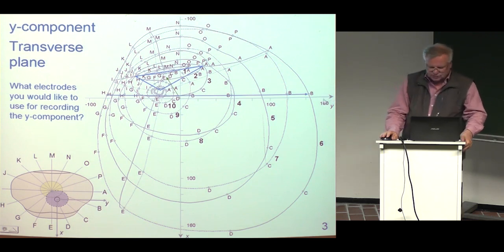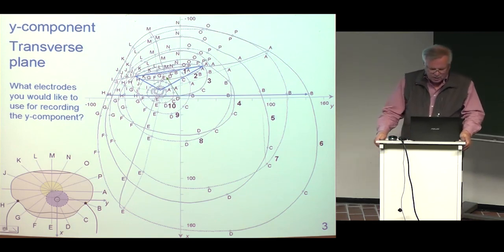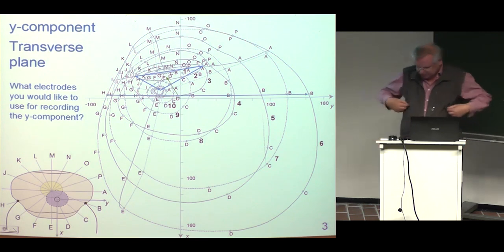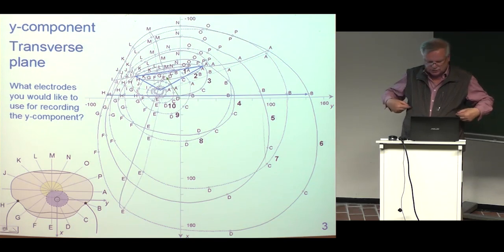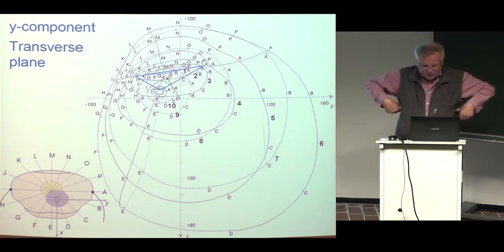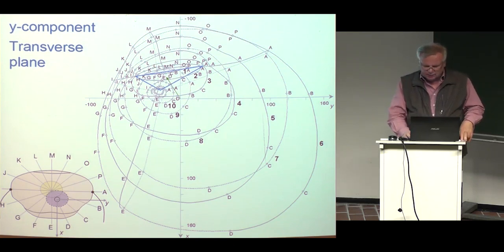So let's have a look at how these points on level 6 look in real space. They are here, B and H. So this is level 6 in this illustration. Between these two electrodes the strongest signal of the Y component of the cardiac vector is obtained. Frank, however, did not select these because he wanted good reproducibility in his lead system. The electrodes are somewhere here, but it is not so easy to find the location accurately. So instead of those, he selected A and I, which are not the ideal ones in the sense of lead vector, but they are the ideal ones in the sense of reproducibility. The A and I on level 6 are here.